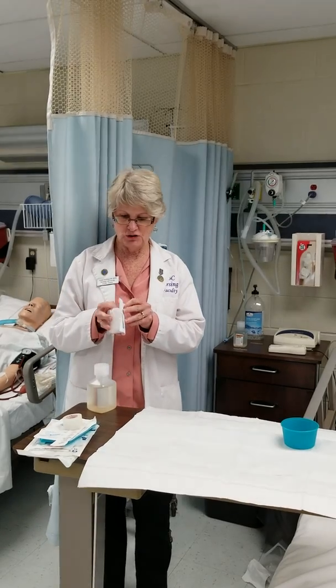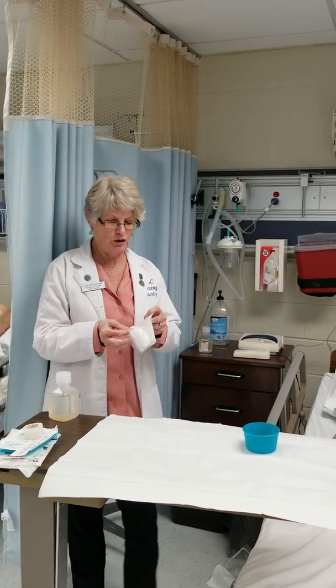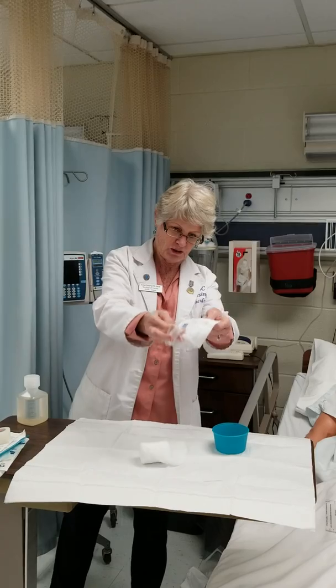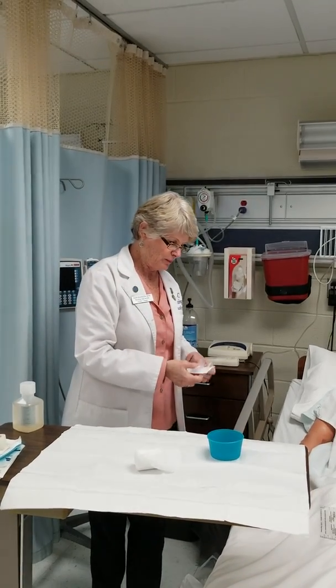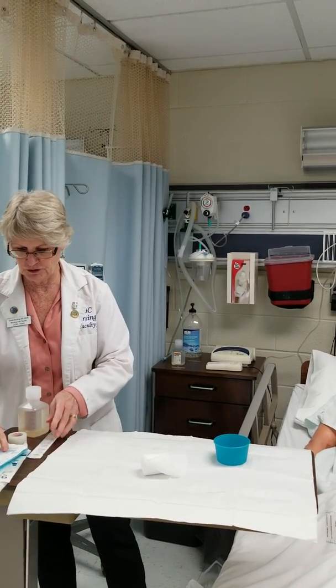This is my sterile cling, which I will use, also peeling apart, lifting, and dropping. Sometimes it may take a little longer, so always try to stay away from the field to make sure it's going to be ready to drop in. You do not want to hover at any time over the field.